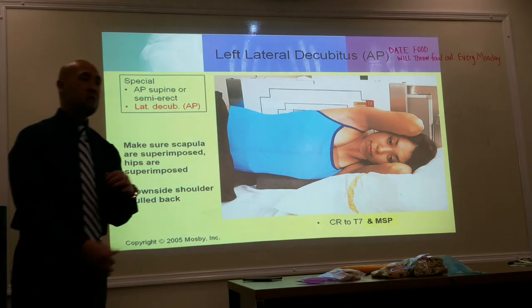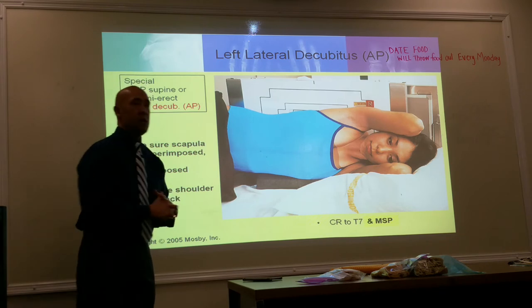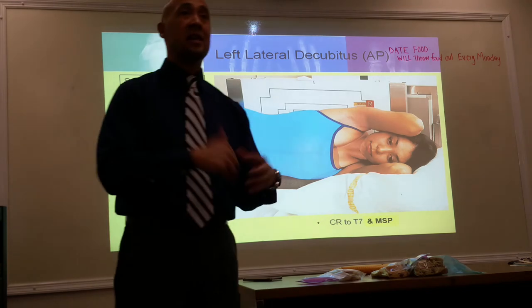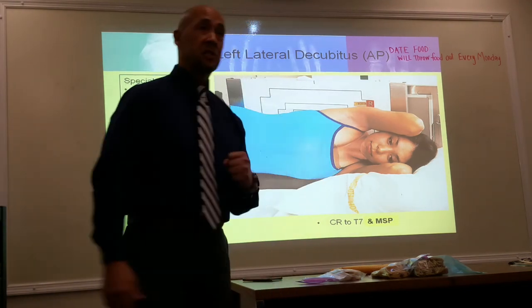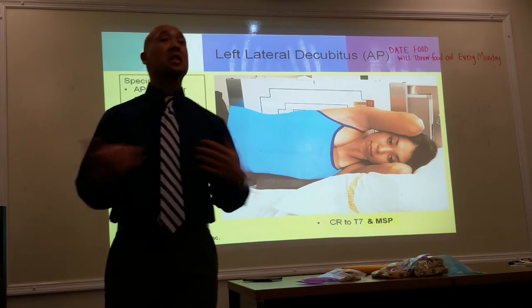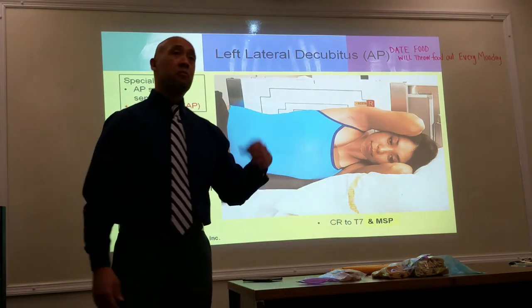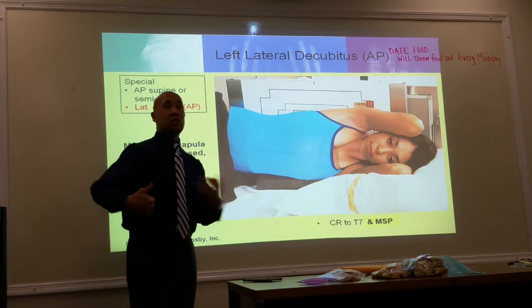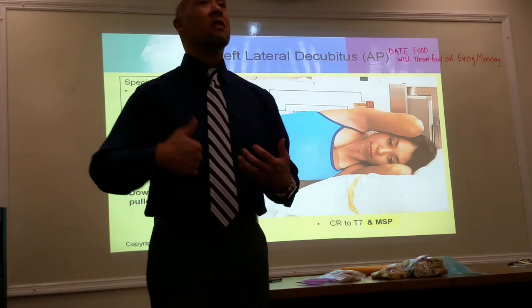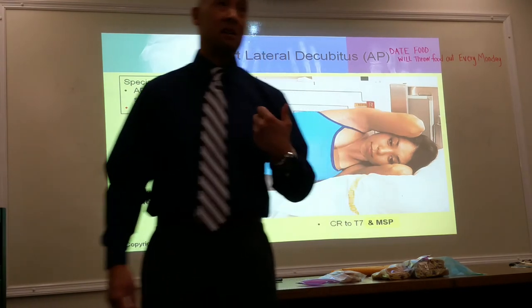All right, let's talk about our decubitus. The purpose of the decubitus is to evaluate for air and fluid levels. So if your patient can't stand up, they're going to lay down on their side. They're going to lay on the side in the area of interest. Okay? So if in previous x-rays they've had issues with the right lung, with fluids, they're going to lay on what side? The right side. If the issue's on the left, you're going to lay them on the left side.